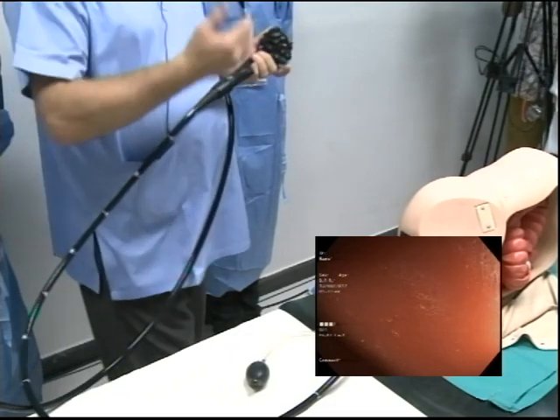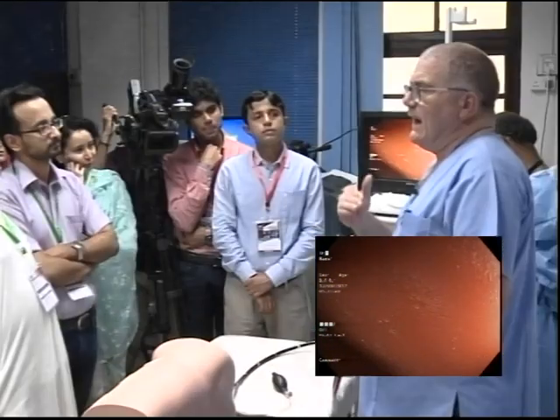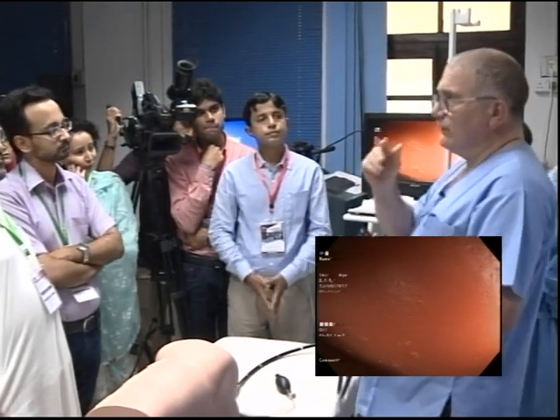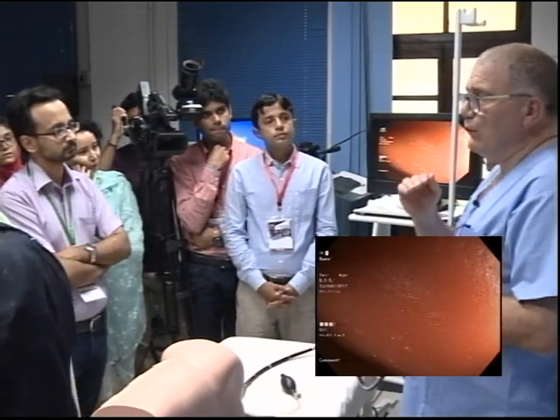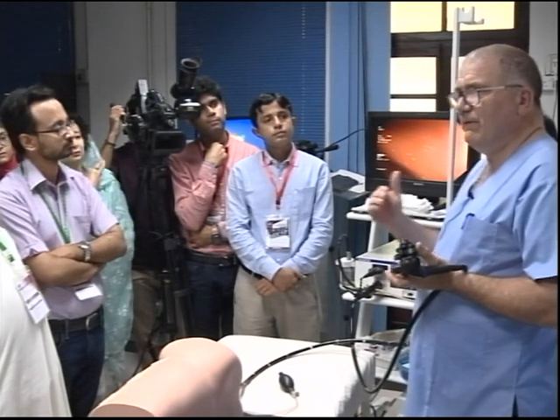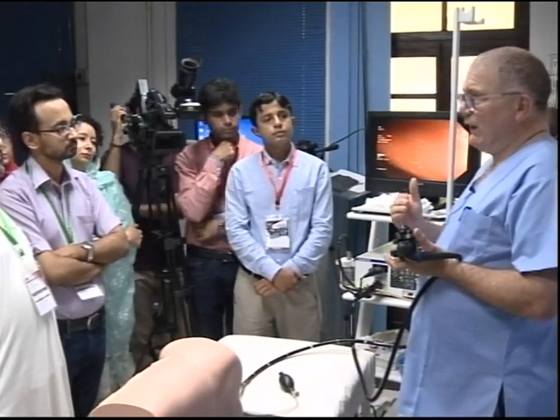Yeah. The last fold, the closest to the anus, helps with regards to pressure, and it actually stops. You need to look up these folds. Look up the valves of Houston. Very important, because that helps you understand anal physiology. It also helps you understand how patients feel and get stimulated when you're doing colonoscopy. But in particular, the first one.